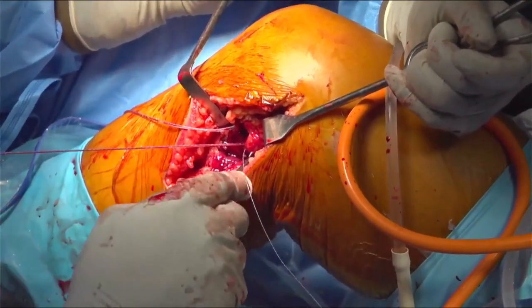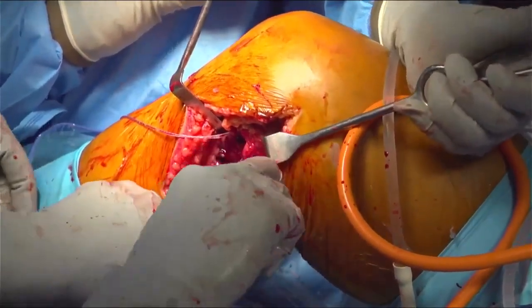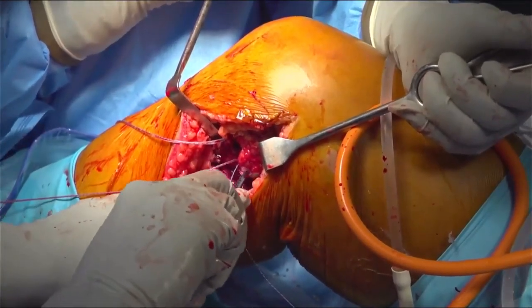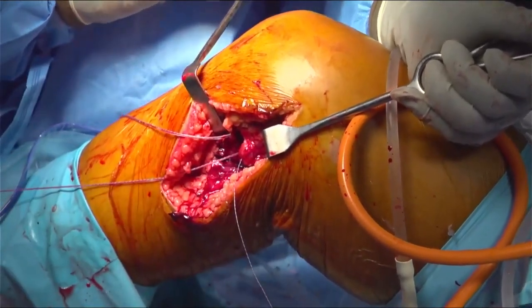So there are two ways. Either you can just pass them sequentially. Here if you can appreciate, this is the area of the semitendinosus tendon. You can appreciate the semimembranosus tendon very well. This is the semimembranosus tendon. The downward one will be the semitendinosus. And then we will be passing these sutures one by one with first pass ST.